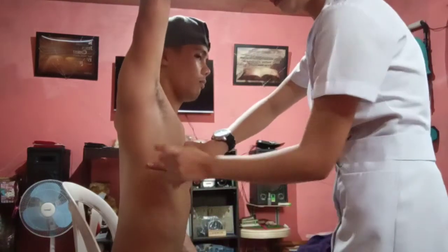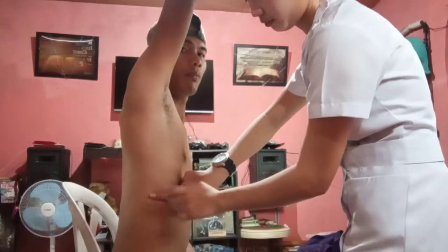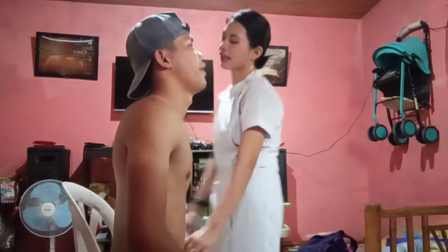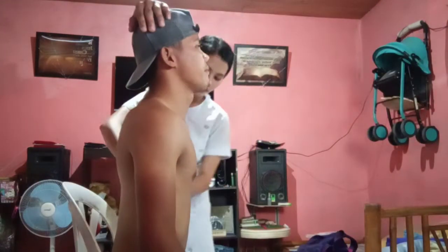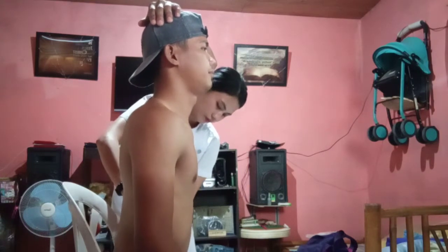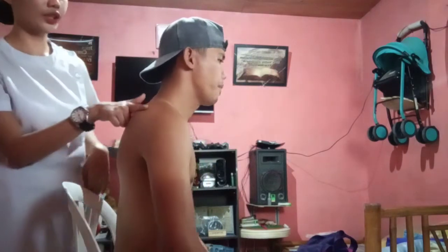And on the lateral. And on the other side to compare the sound. And on the posterior part.